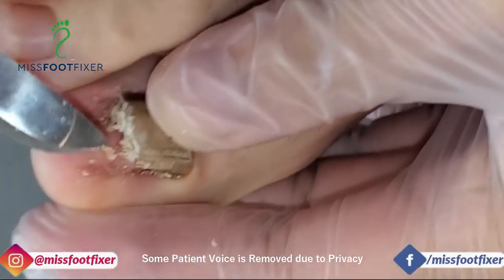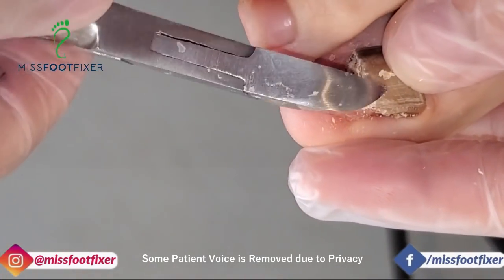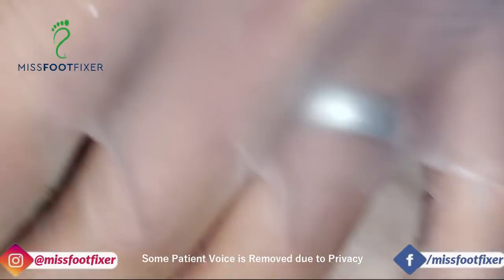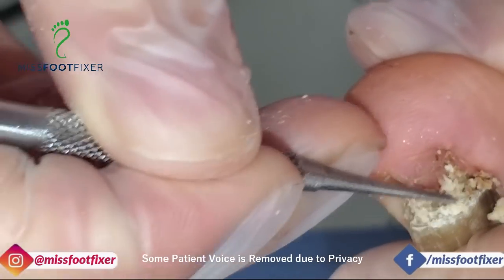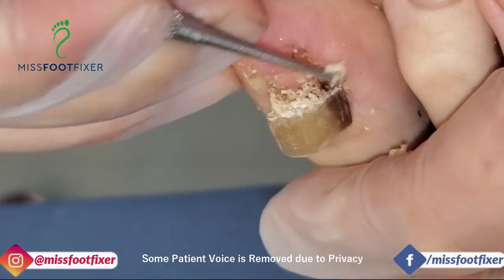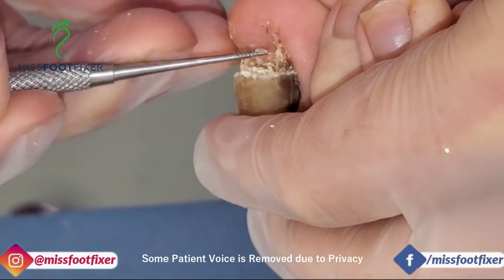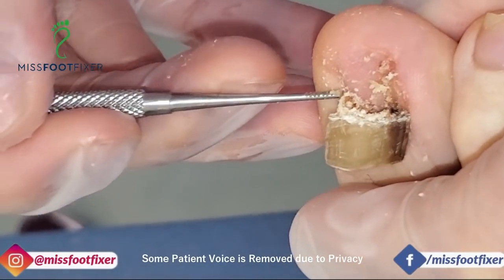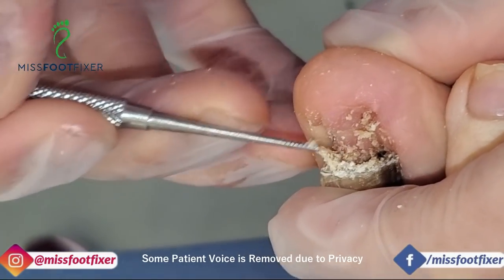You can remove the debris. Yeah, let me just pinch all the... Let me use a file. There you go. That's about as far as I want to go. I know you could do more, but let's file it down. You can use the drill piece to clean inside. Yeah, it's getting sensitive. Let me just get rid of this in this gap. I just want to get rid of this little pointy bit here.